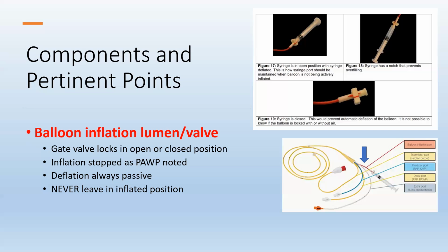That is the major effect of a catheter whipping the endocardial layer of the ventricle. And therefore, this balloon being inflated is now going to soften the movement or the pressures against the walls of the ventricles. Okay? So it acts for that particular reason.